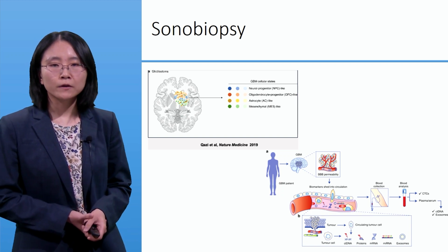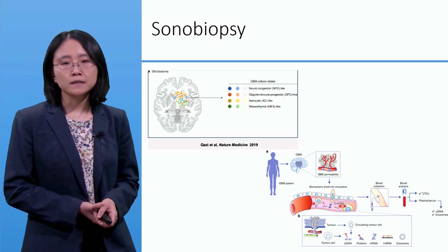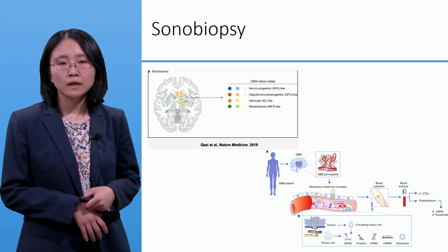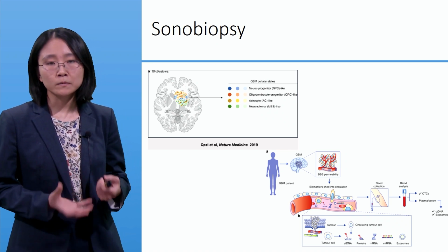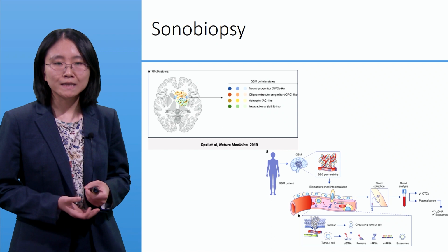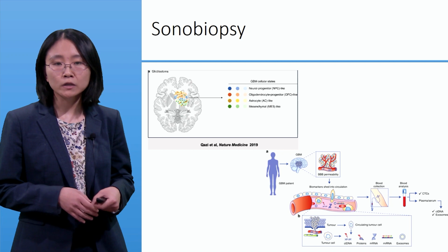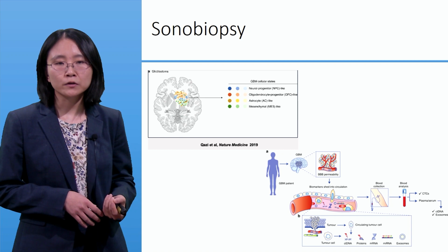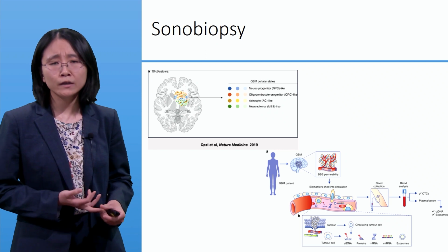Another potential very interesting area of using focused ultrasound is liquid biopsy. Liquid biopsy is the ability to sample a pathology through non-invasive methods such as blood collections. Typically, and this has been well established in patients with systemic tumors, where their tumor cells or tumor DNA and other biomarkers are leaked into the systemic circulation, and blood can be drawn and tested for these biomarkers for diagnosis, surveillance of disease progression, and treatment response.